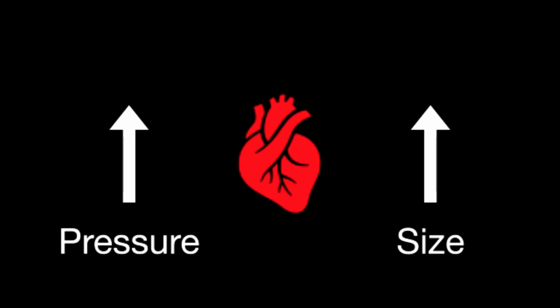And what happens is that when the right ventricle contracts, it actually sends down a pressure wave that goes forward into the pulmonary artery. And then the pressure wave reflects back from the pulmonary artery back to the right ventricle. And it shows up in the form of the pulmonary artery ejection. The more proximal the obstruction, the more rapid the rise in pressure in the right ventricle is. And you will see, again, in the acute phase that the pressure simply just doesn't go above a certain level.